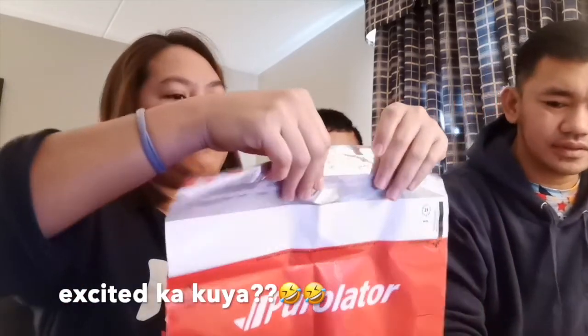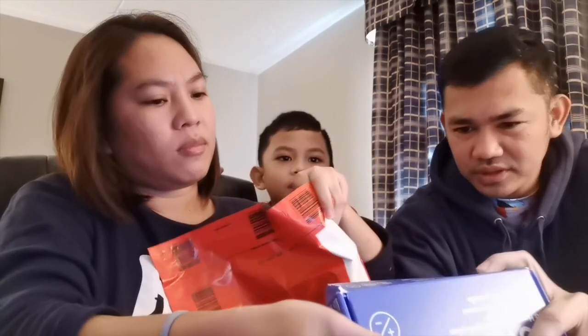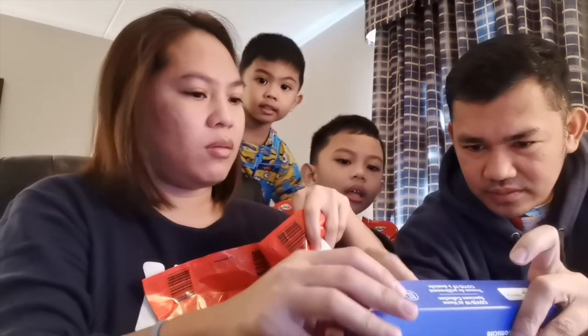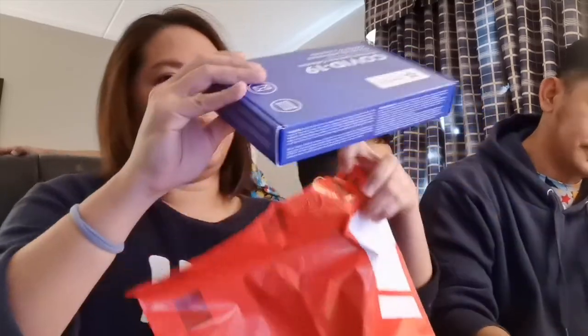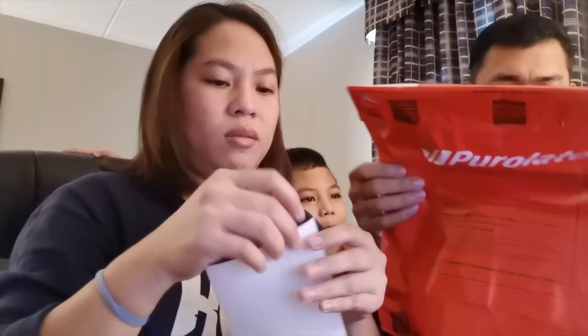Put it with the circular sticker. Not that one, this one, to seal. Okay. Now you put it in the Purolator bag. Zip it, and then seal it. Awesome. And then you have the sticker, that label. You put it on top.